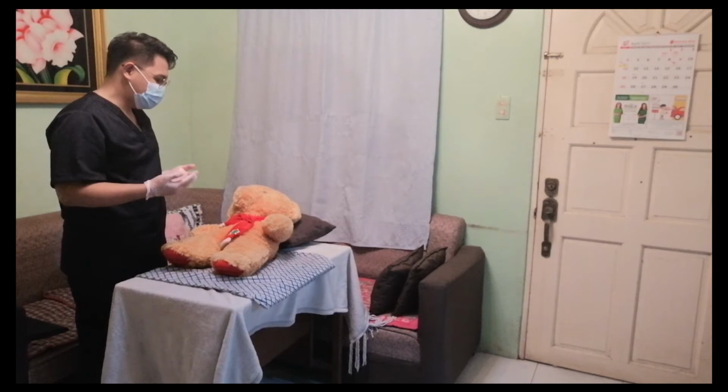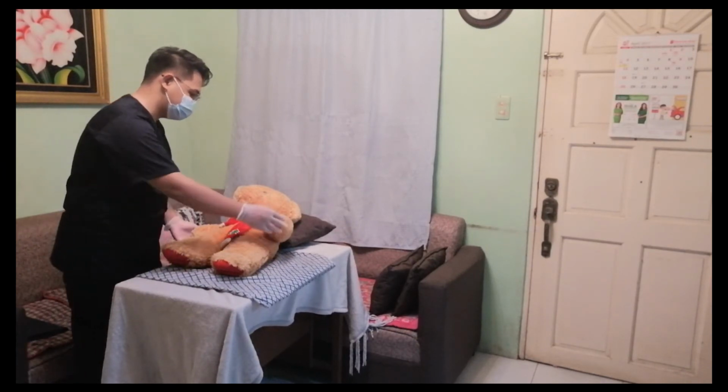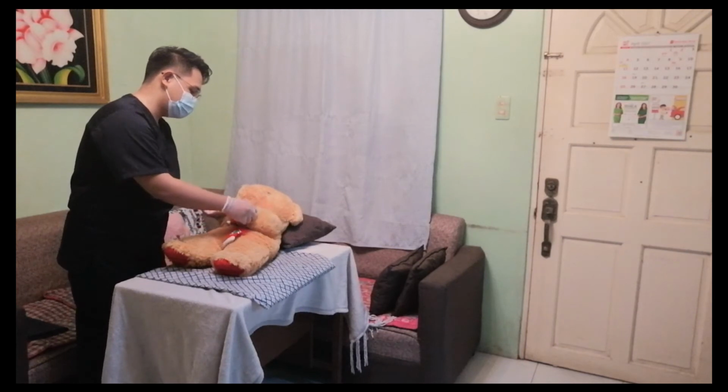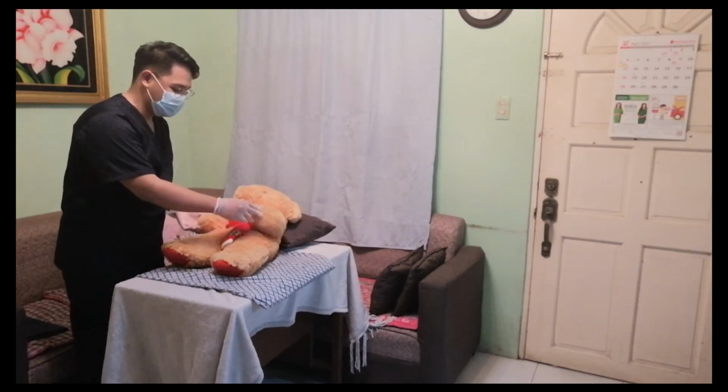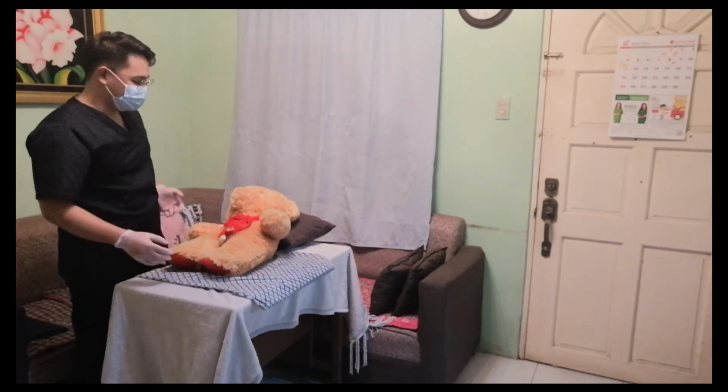So ma'am, pwede niyo po bang i-cross po yung inyo pong arms? Let's say for example, here, she has already crossed her arms and both legs have already been crossed. And for our 9th step, if available on the bed, we will be activating the bed mechanism of the bed to inflate the side of the bed behind the patient's back.